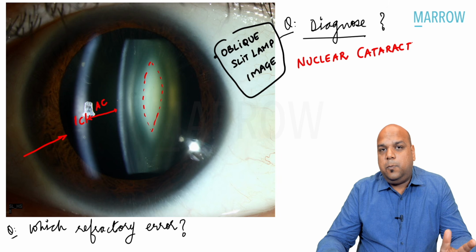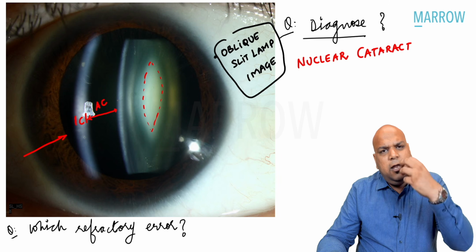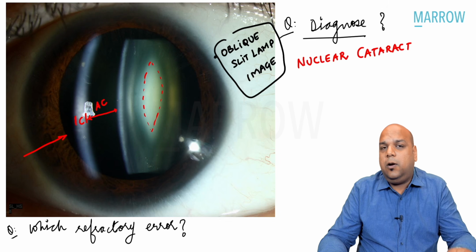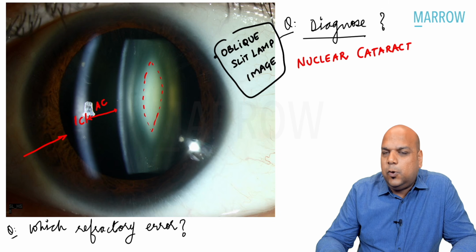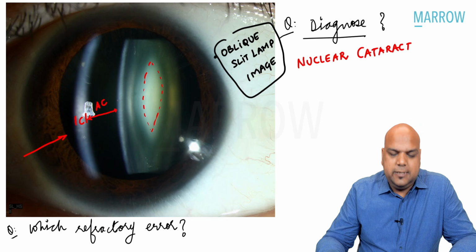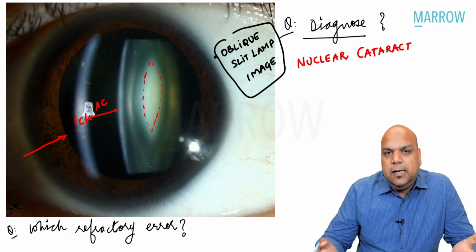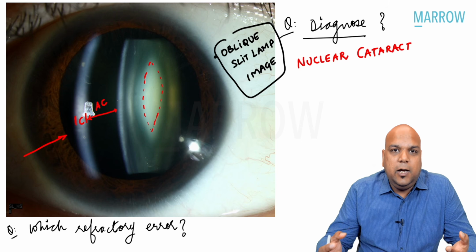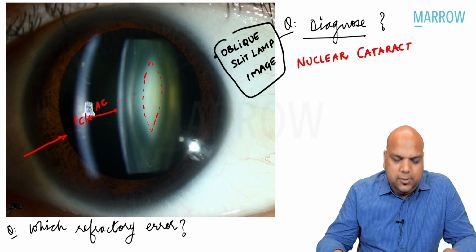It is not blood orange or brown in color, so it's not highly progressed, sir. It is probably an early stage of nuclear cataract, more likely nuclear sclerosis grade 1 or grade 2, sir. All right, that is how we see on a slit lamp the stage of the cataract, and which type of cataract. That is what we actually do when we are examining a patient as an ophthalmologist.